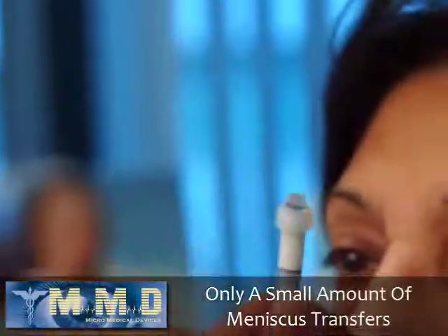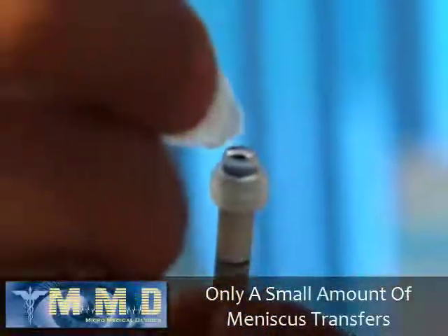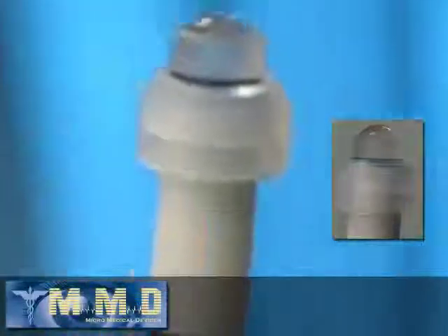And again, as you can see, only a very small amount of the meniscus on top was transferred to the eye. And I will put half a drop more to form the meniscus again. I like to zoom in right on top of the meniscus if it's possible, so you can see this is the perfect amount of meniscus. And at this point, I'm going to do the left eye.